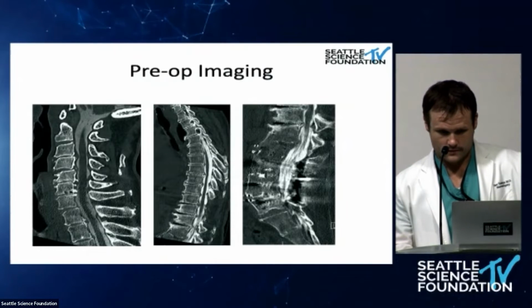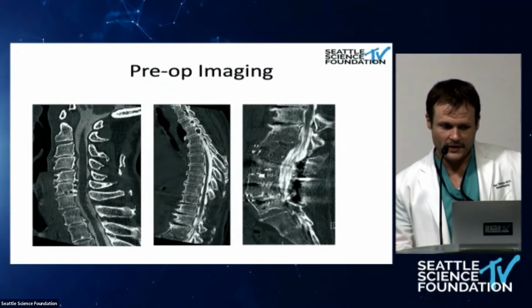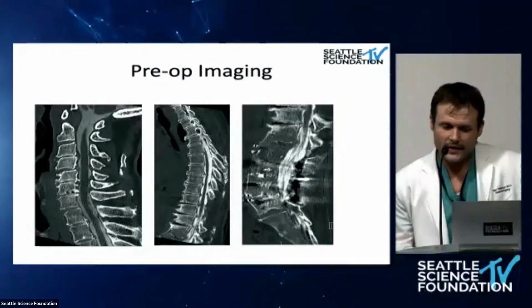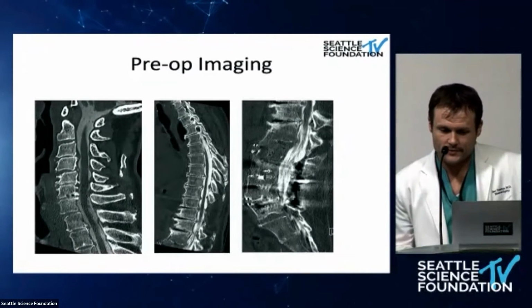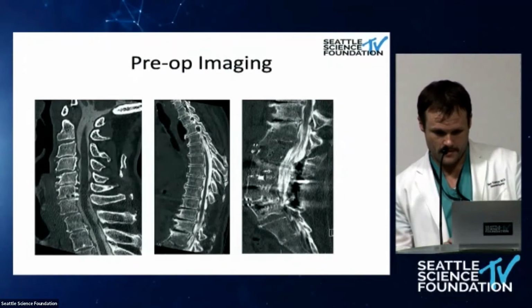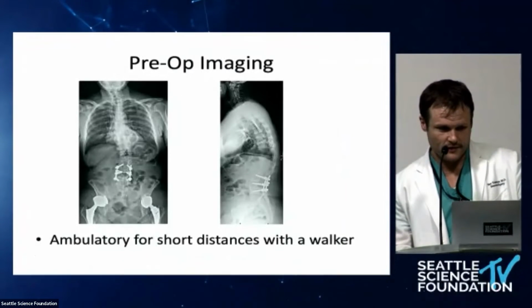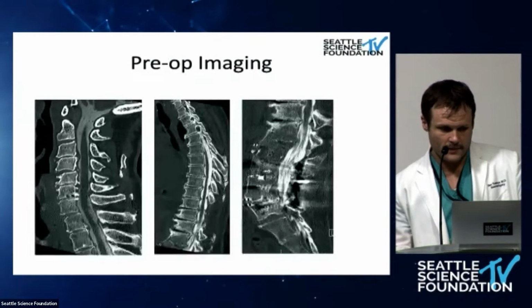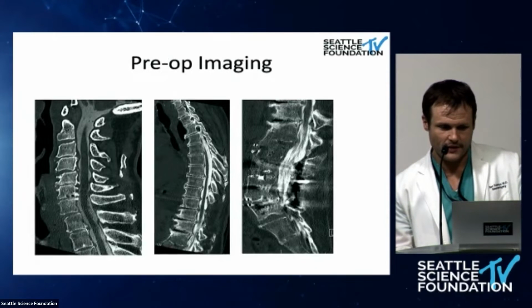So what was her main issue, Zach? Her main issue was back pain, hunched over deformity, and right L5 severe radicular pain. Okay. And do we have some upright images? Yeah, these are her uprights. So not horrible. But she looked pretty tight. Is it L1-2 or L2-3? And also down below, I couldn't get a good foraminal slice, but she had foraminal stenosis at L5-S1.